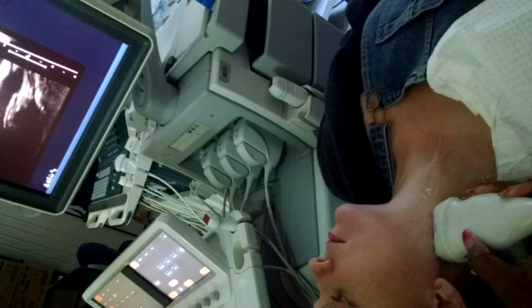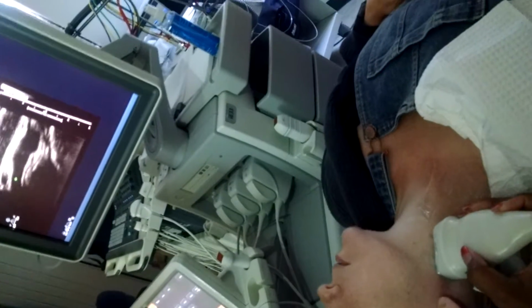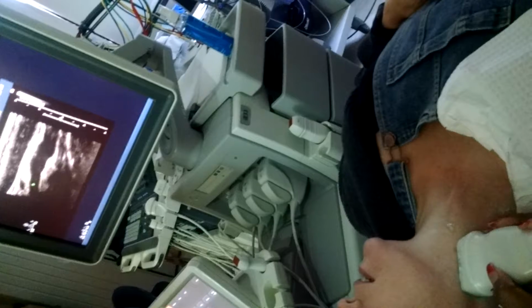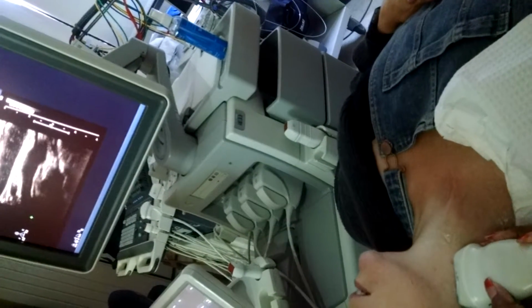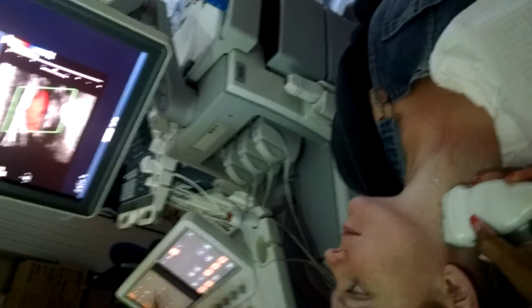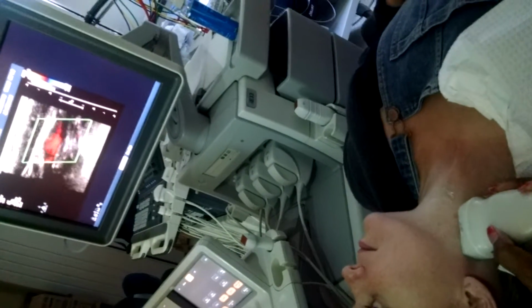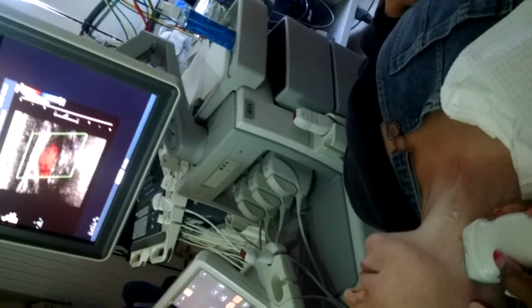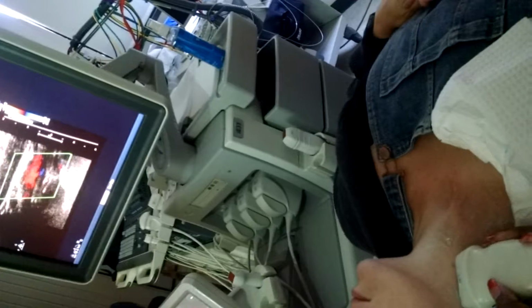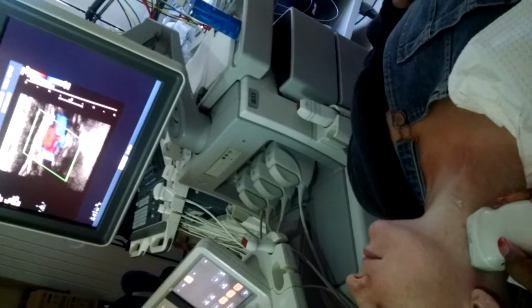And then if I want to go to, I'm trying to show color compare on this machine. Like the inferior lateral. Yeah, that would be good to know, because I don't remember seeing it, but I wasn't looking for it either. Colors up here, sorry. My nails are not conducive for touchscreen at all.